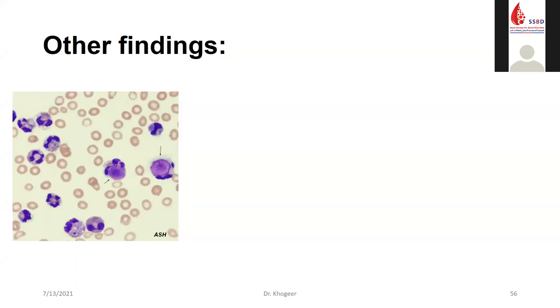That's correct. So this is engulfed material, usually coated by antibodies as LE bodies, and then ingested by a viable neutrophil. And as you can see here, the nucleus of the neutrophil is pushed to the periphery. LE cells are an in vitro phenomenon, rarely found in vivo. Anticoagulated blood is agitated inside the tube by an unknown mechanism, so that nuclei are released from the disrupted leukocytes, and another neutrophil will ingest this body, which we call the LE body. Again, LE cells are characteristic of SLE.